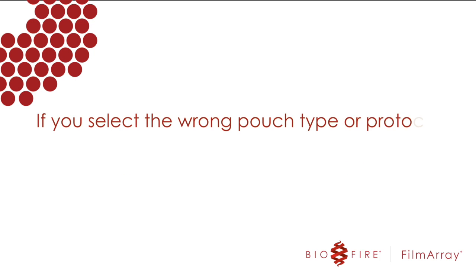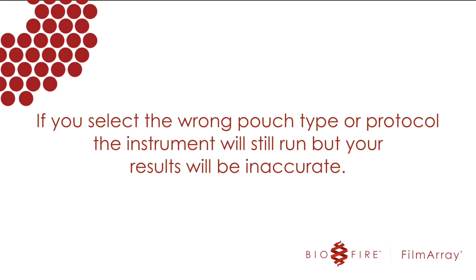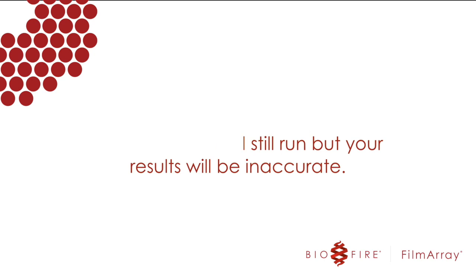If you select the wrong pouch type or protocol, the instrument will still run, but you will have very inaccurate results usually ending with a control failure.